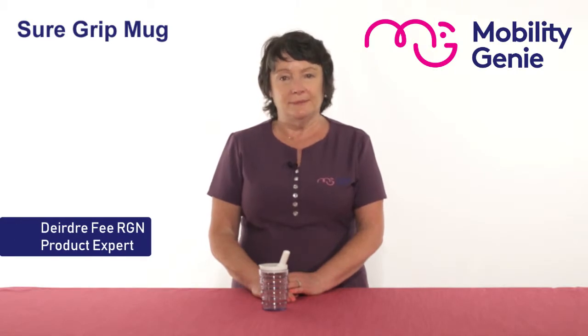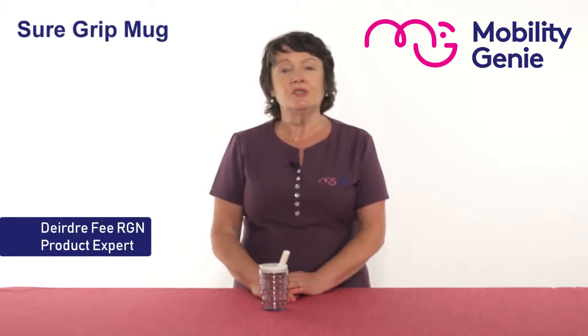Deirdre from Mobility Genie. At Mobility Genie we are constantly asked for feeding cups, because for one reason or another a person can't use an ordinary cup or glass.